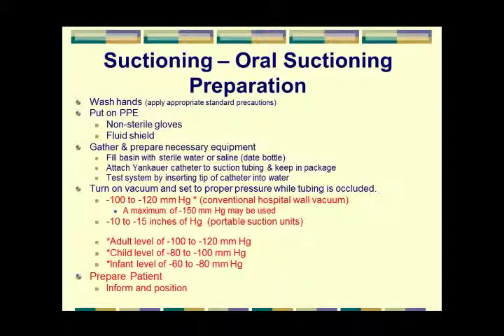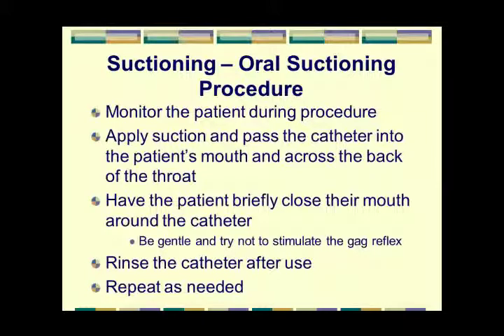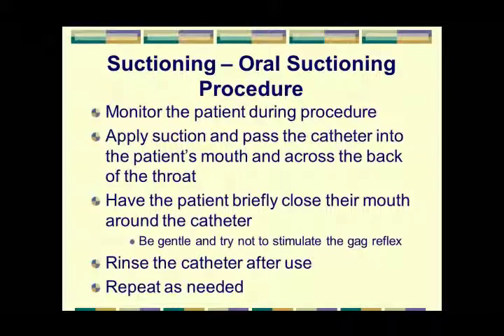I talk to my patient and inform them what I'm going to do. I'm going to clear out the back of your throat. You may feel a little bit uncomfortable. And we're going to go ahead and apply suction while we pass it through the patient's mouth to the back of the throat. Got to be careful not to go too deep because you'll induce a gag reflex.